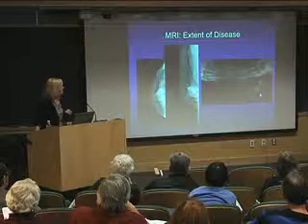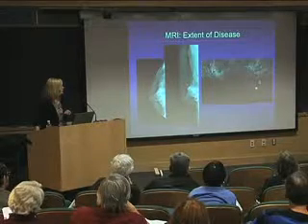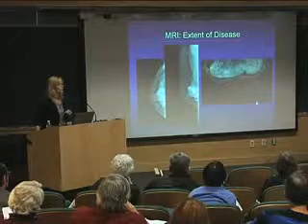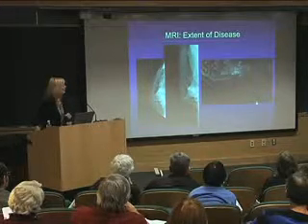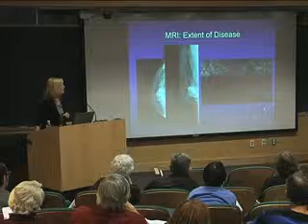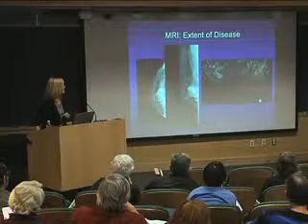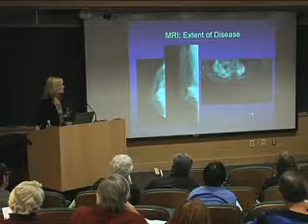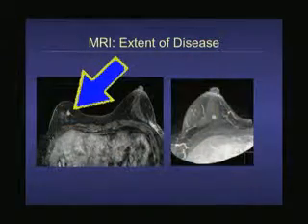We're about to see the contrast, and I want you to pay attention right in this area. It's coming, and boom. Did you see that little white bright dot? Just flew by you like that. We're going to get one more chance at it. This is the delayed. And look right in that area. And boom, that little white dot. That, my friends, is a little invasive carcinoma that we could not see.